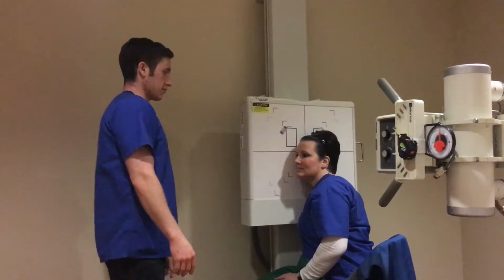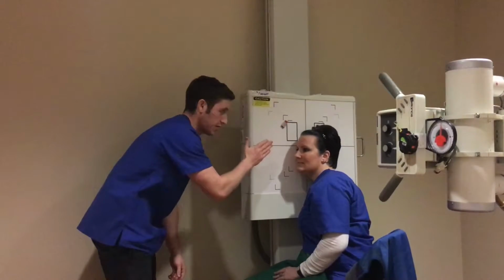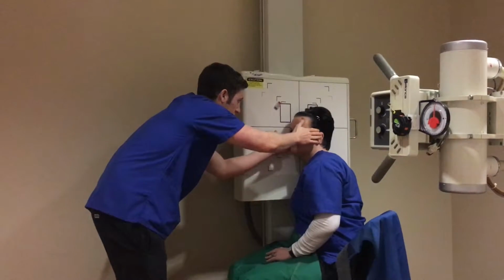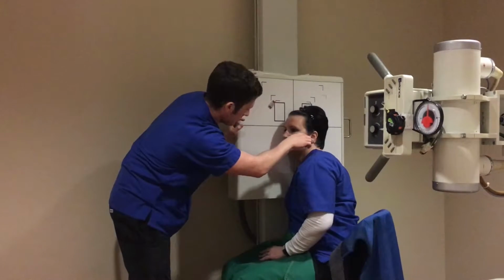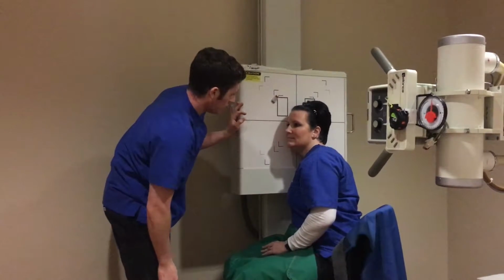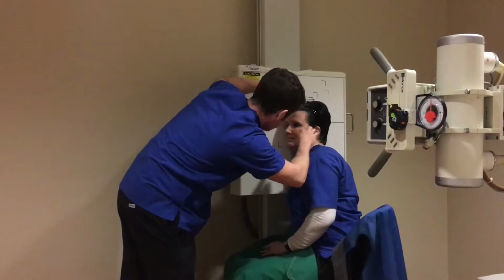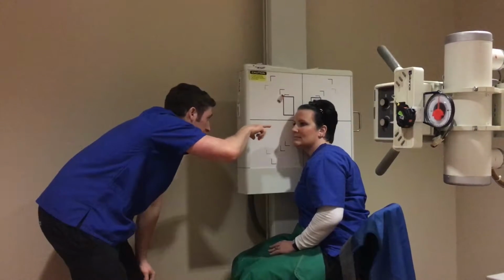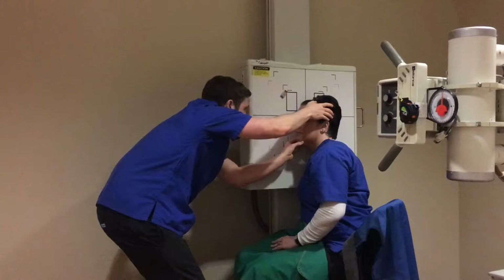The three baselines I'm going to be using for this are the mid-sagittal plane, which I want to be parallel to my image receptor. This is going to control rotation. I want my IOML or infraorbital meatal line parallel to the long axis of my IR. This is going to make sure that her head's not overflexed or overextended, so that looks good. And then I want the IPL or interpupillary line perpendicular to the image receptor. This is going to control tilt.